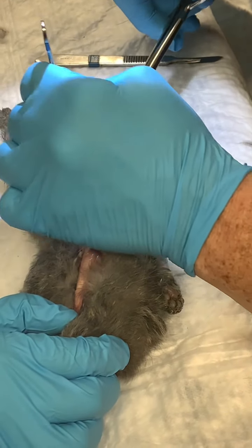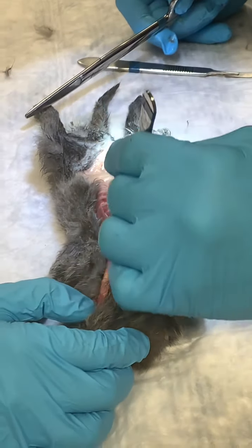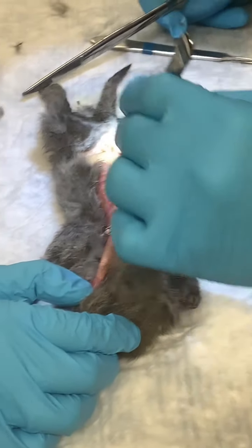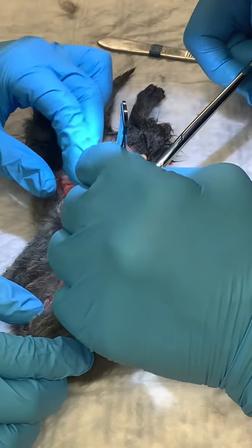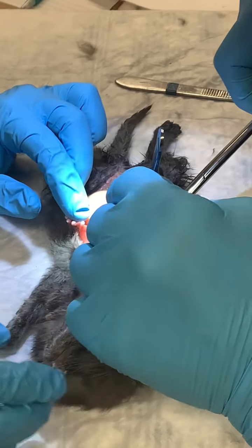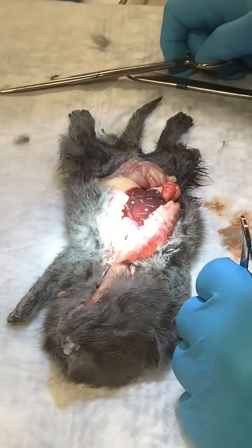We did have a lot of inflammation there in the small intestine. I think we have a little bit of a mottled appearance. Some of that might be some post, and this lung is pretty hemorrhagic.